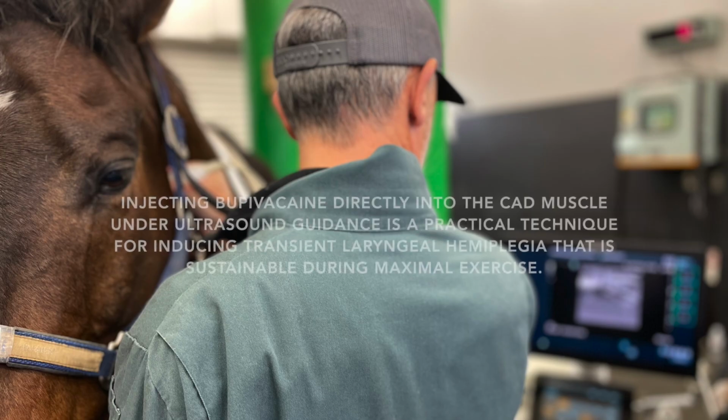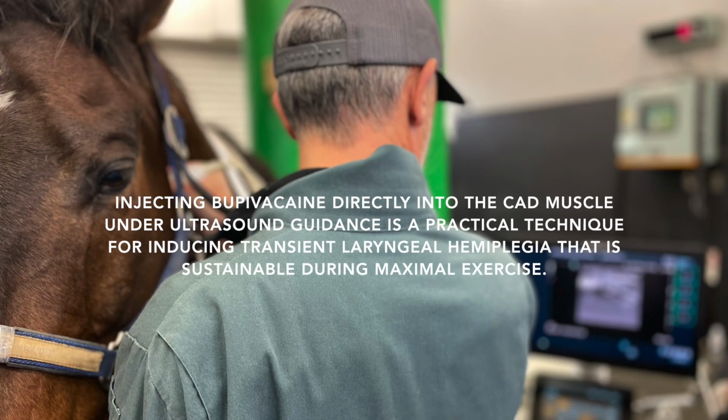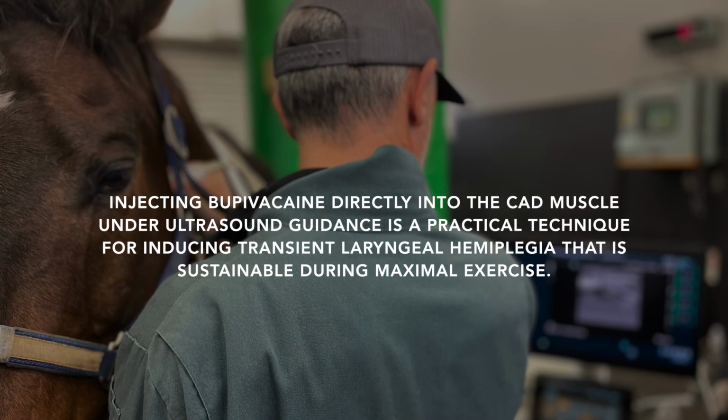Injecting bupivacaine directly into the CAD muscle under ultrasound guidance is a practical technique for inducing transient laryngeal hemiplegia that is sustainable during maximal exercise.